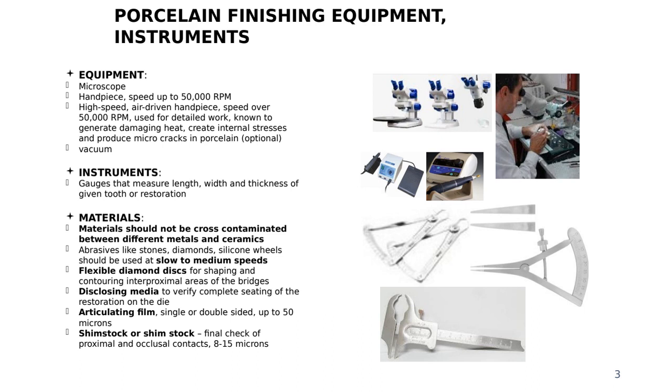What we need to do, so what we're using in terms of grinding and reshaping to the anatomical contour. So in terms of equipment, we need a microscope. Why do we need a microscope? To see the details.